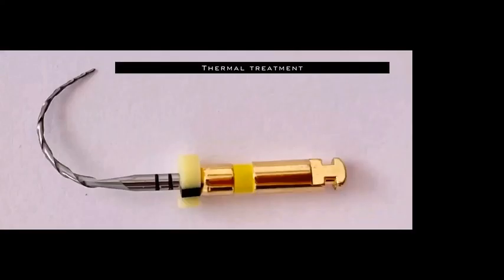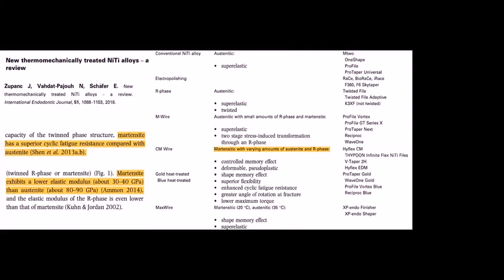Another important thing that we have to analyze is the alloy that the file is made of. Why? Because there are a lot of kinds of NiTi, and some of them are more flexible and more resistant to cyclic fatigue. So, summarizing, we can find NiTi files made of martensite NiTi.